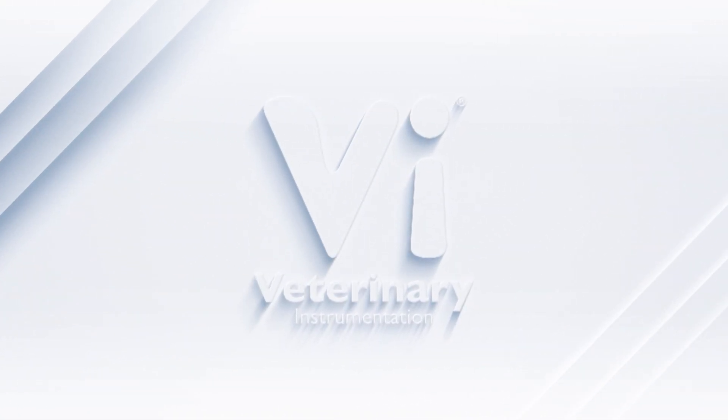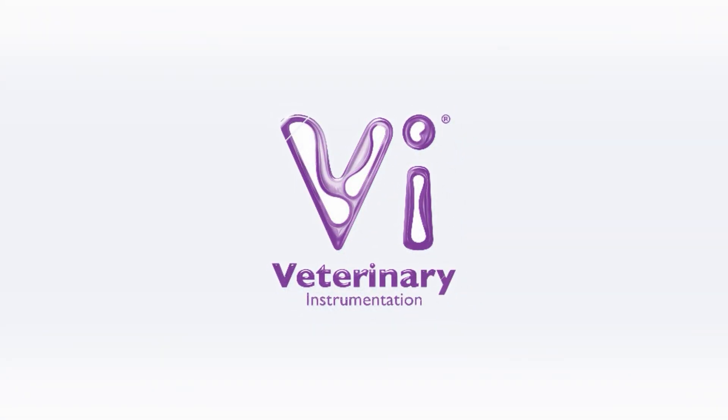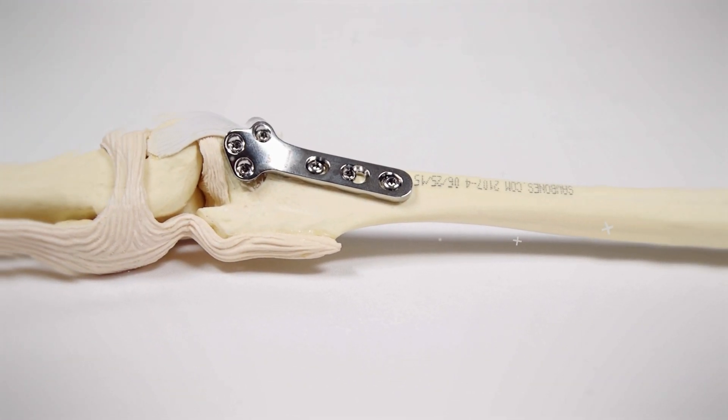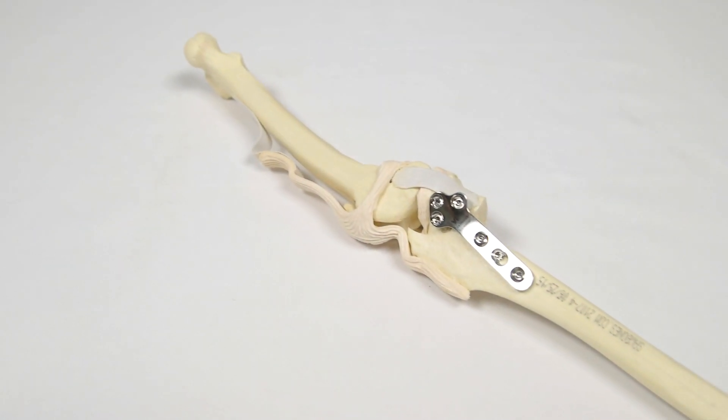Hello and welcome to Veterinary Instrumentation's latest episode of Under the Skin, a videography series introducing key devices and techniques used during orthopedic surgery. In this episode, we are looking at radial cut tibial plateau leveling osteotomy.